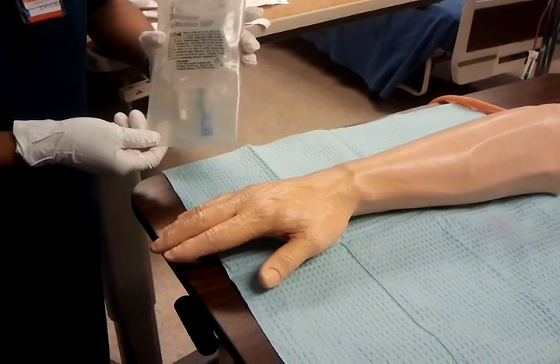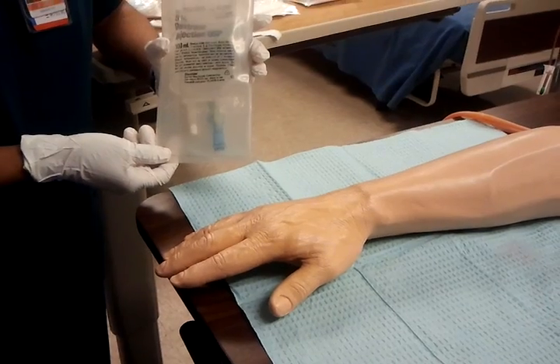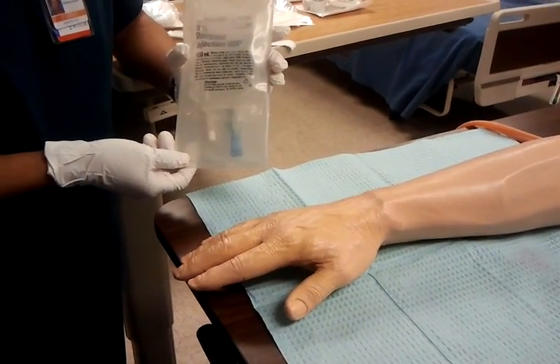Doing a video on how to start an IV. First, we're going to start by verifying the physician's orders for the IV therapy.